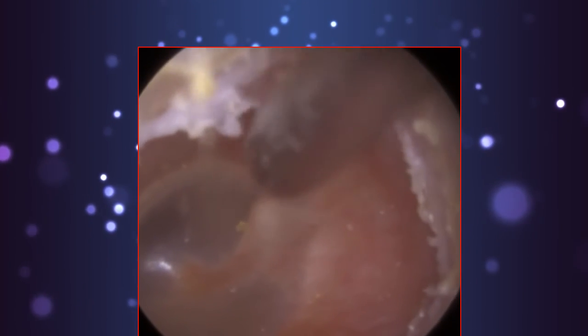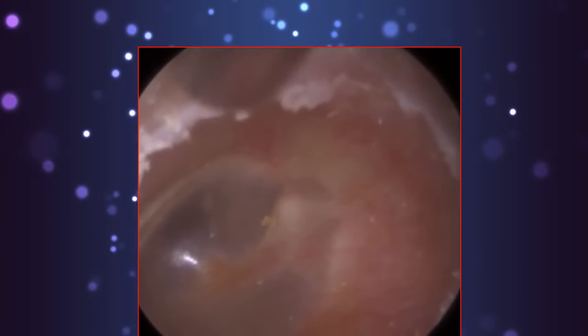Alright, guys, I'm going to finish the narration there. It's just me peeling off the skin.